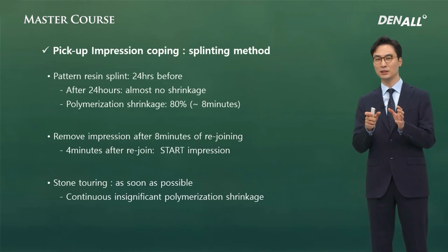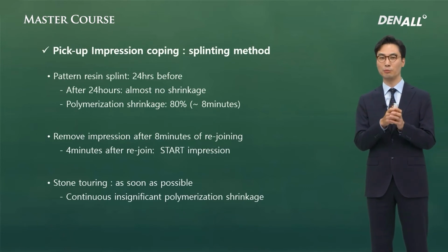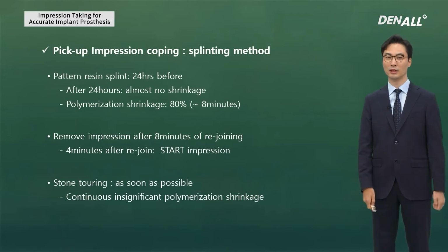If you do not do splinting using pattern resin, the coping is set using just a polyvinyl siloxane. Therefore, you don't need to pour stone immediately.